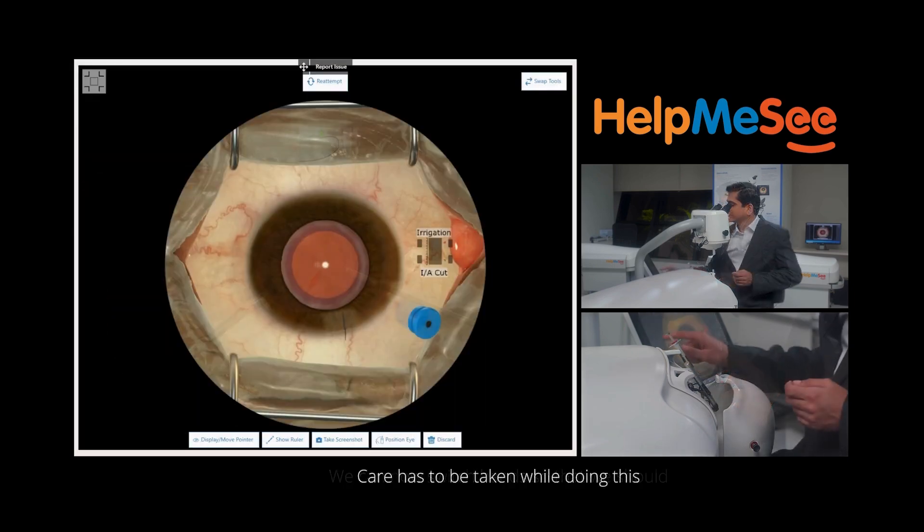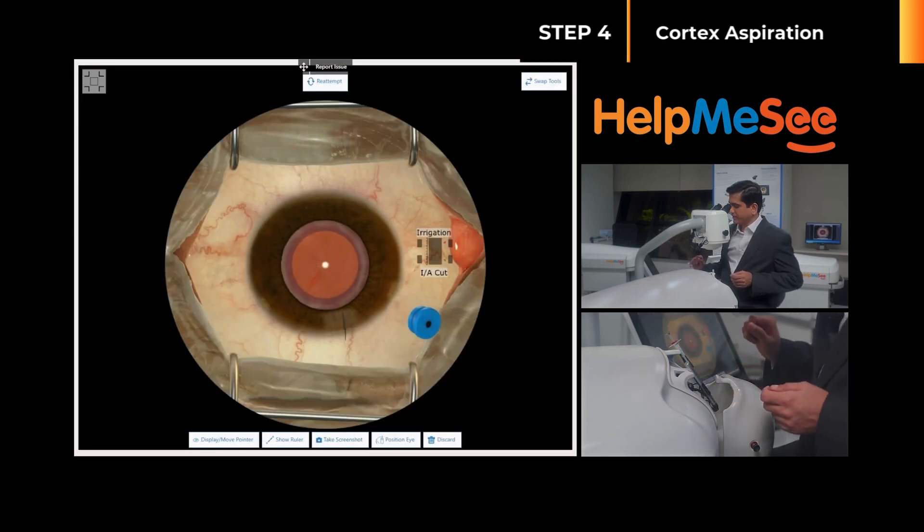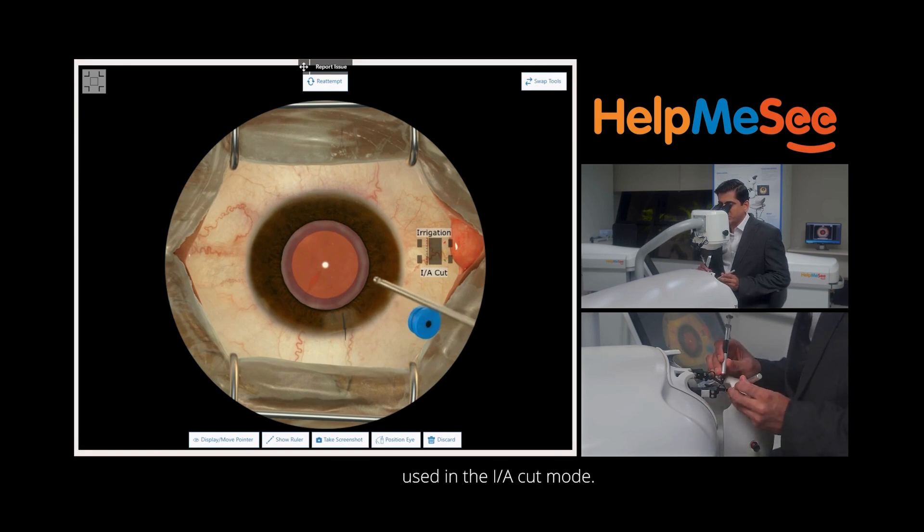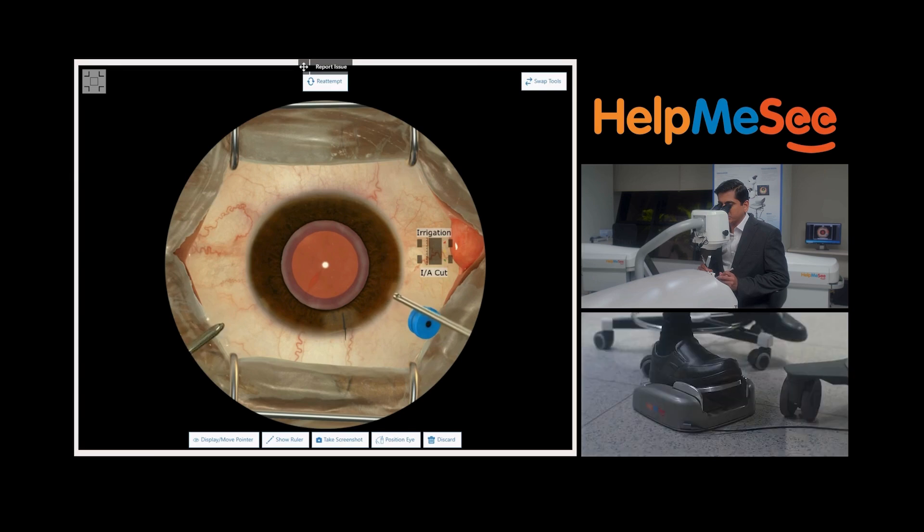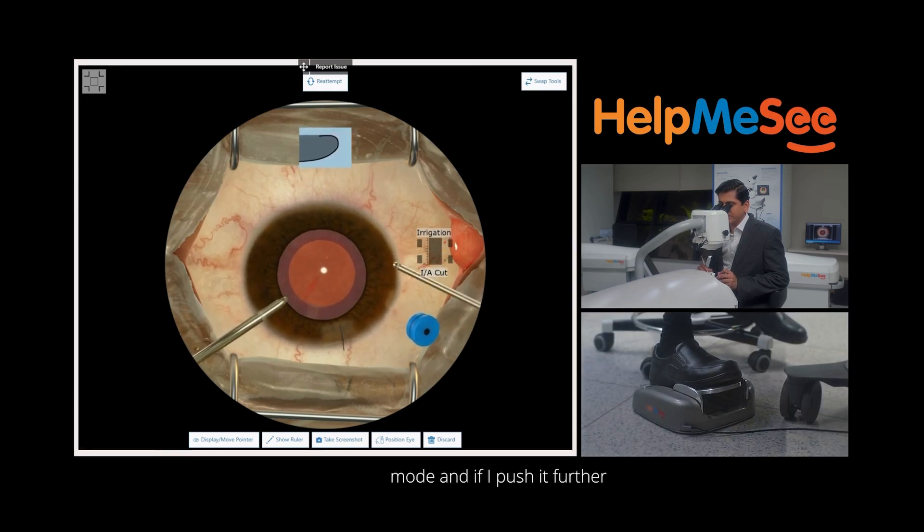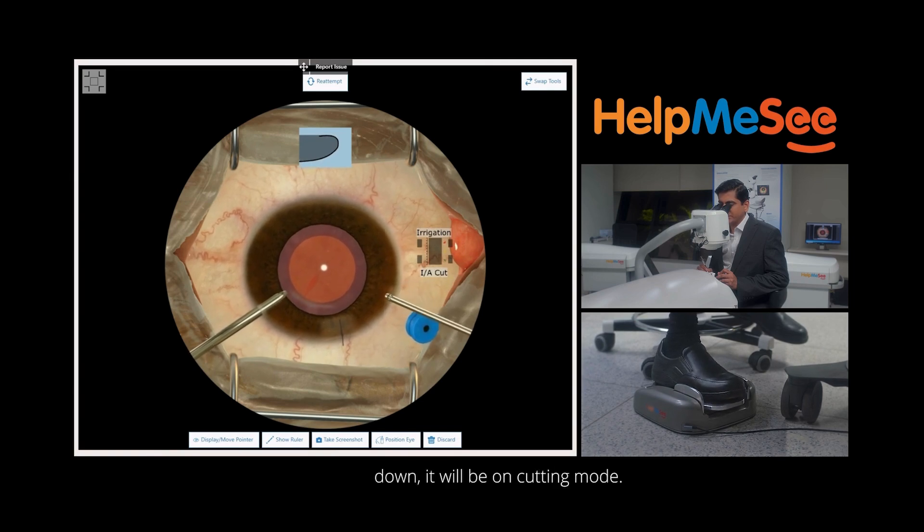Care has to be taken while doing this step because we might damage the anterior capsular rim with the cutter. The cutter is going to be used in the I/A cut mode. When I first push the foot pedal it will be on aspiration mode and if I push it further down it will be on cutting mode.